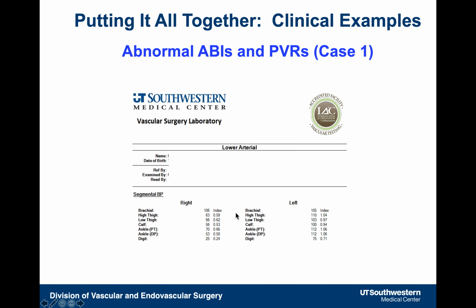I then would look at the pressures up and down the legs. This is high thigh, low thigh, and they look fairly stable. There's not a dramatic decrease. And then the toe pressure is greatly diminished to 25 with a toe brachial index of 0.24 on the right, whereas on the left, the numbers are normal throughout, and you have a very preserved toe pressure with a toe brachial index of 0.71, which, as we said, anything over 0.6 is normal.